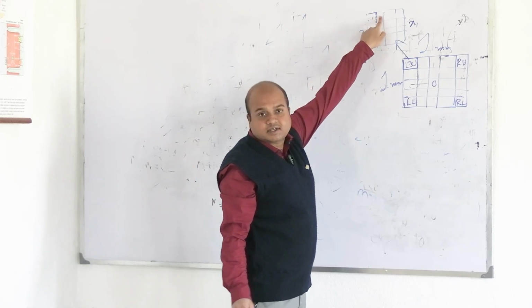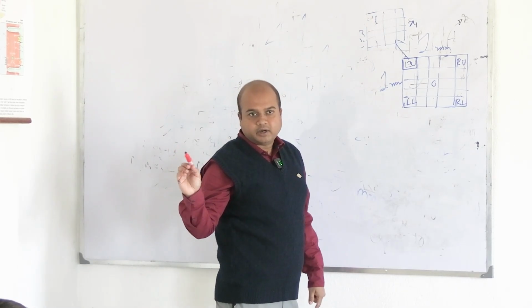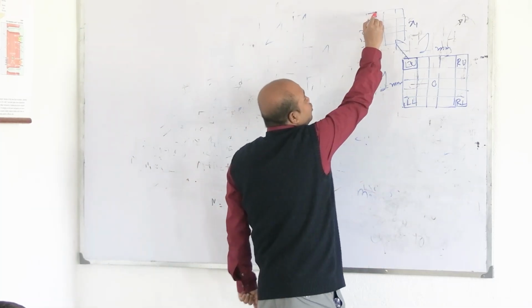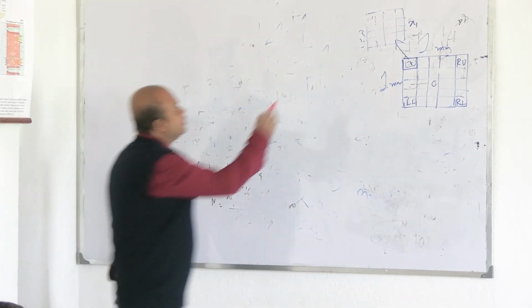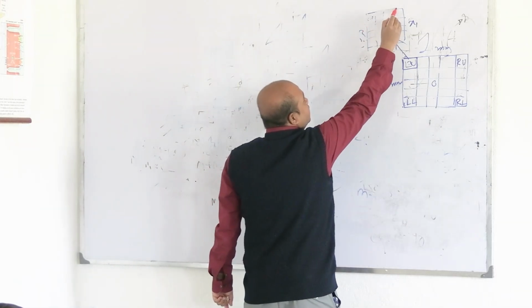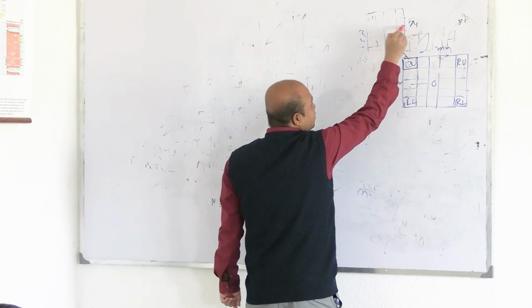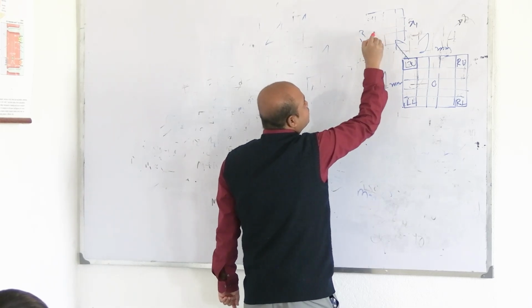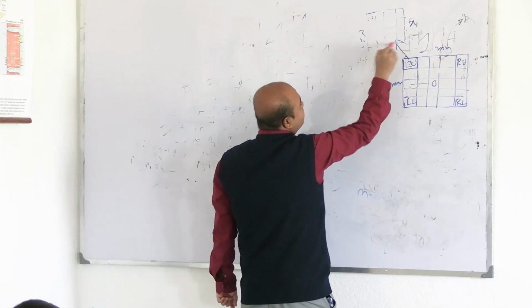Then during this counting, we consider this margin. Now, this margin is not double counted. Okay. So, this rule of L, now this goes away, instead of red color, vanishing color. Now, again this L, let it vanish. Let all these vanish. It will be easier to understand, I think. So, this is a boon in disguise. Everything is vanishing.